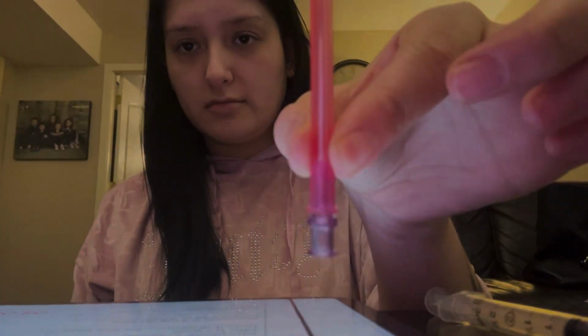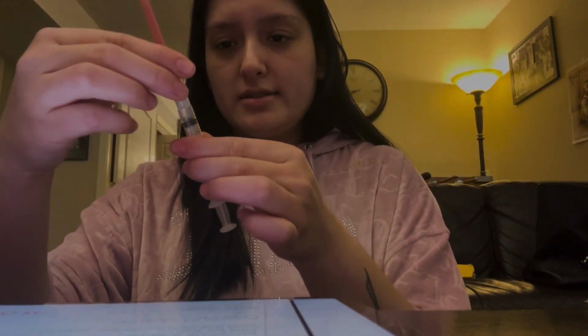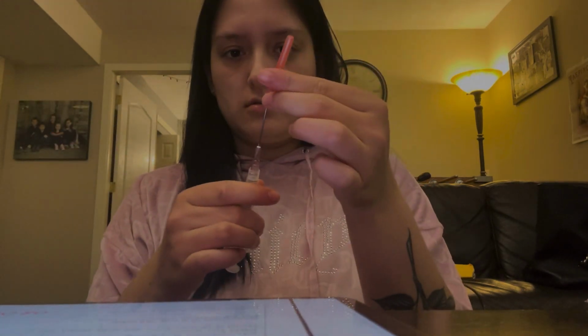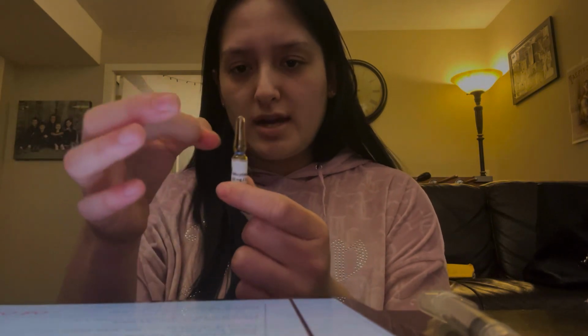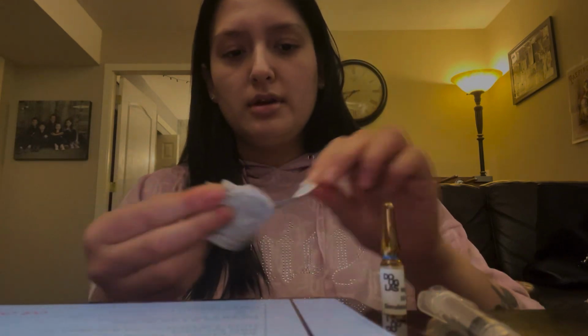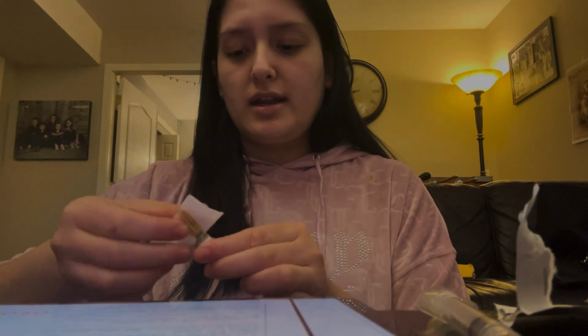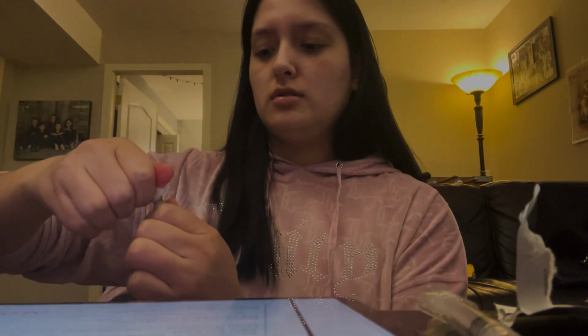Blunt fill needle filter. I'm gonna be placing this on there like so. Blunt fill needle filter is on. Now I'm going to be breaking open the ampoule and ensure that there's no air bubbles. There's no air bubbles. And I'm going to take an alcohol swab, and I'm going to clean the surface of it, and I'm going to remove the top of the ampoule. Clean, and I'm going to put this in a hazards bin.